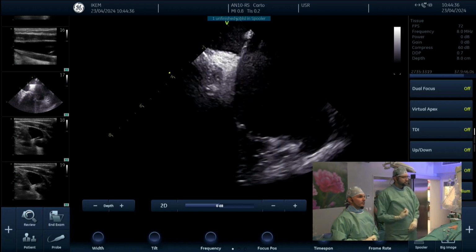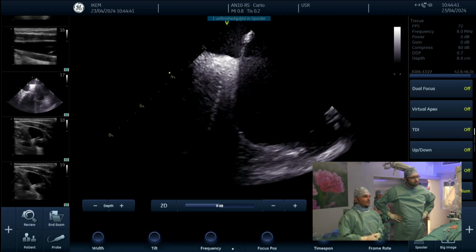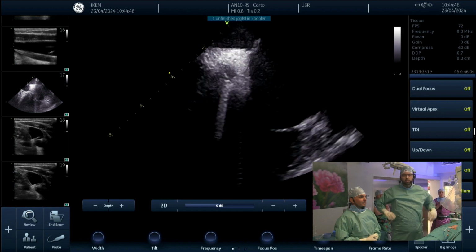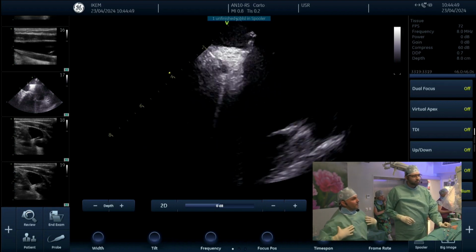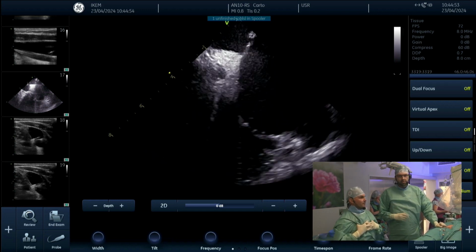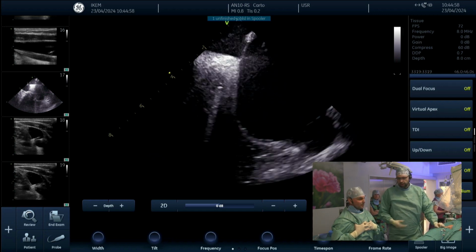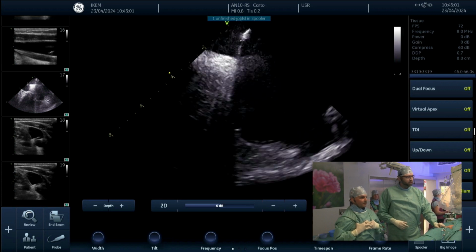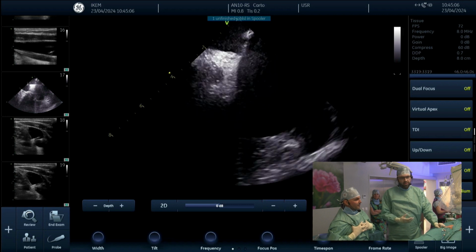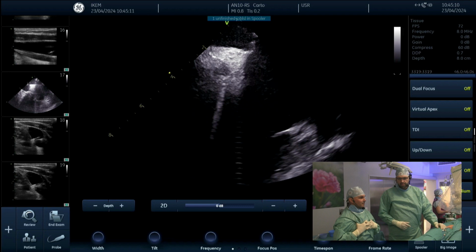You see here, fossa ovalis starts here. So the first lesion was here, the other here, and here. And one more comment: because we are doing this vagal nerve stimulation only anatomically under fluoro, usually we have a very good response. But this is perfect that we have an additional tool for patients, that if we have an obstacle we can overcome it. So this is great.